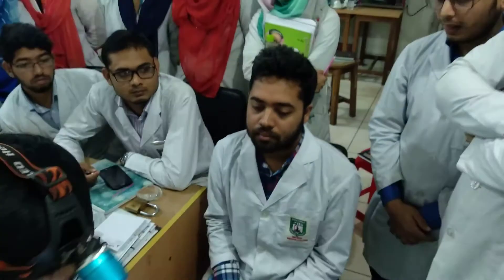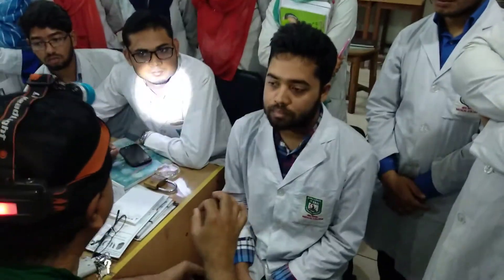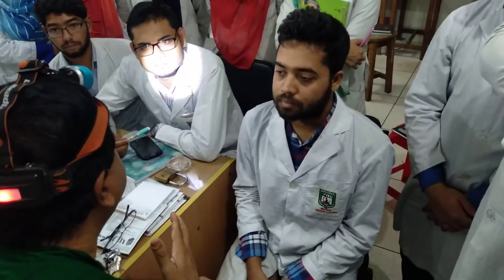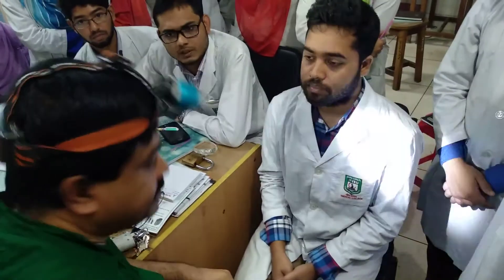This is fine. The wall is closed. This is closed. So we will see a lot of anterior rhinoscopy. We will try to get a posterior rhinoscopy. You can see it. There are two different parts — so it's a tongue depressor, posterior rhinoscopy mirror, PNS mirror.